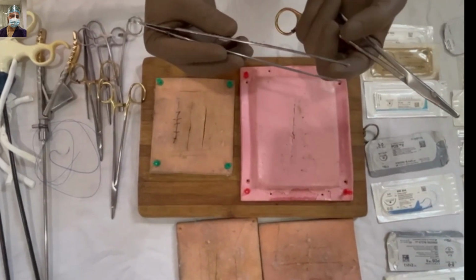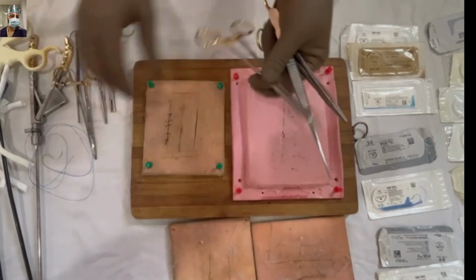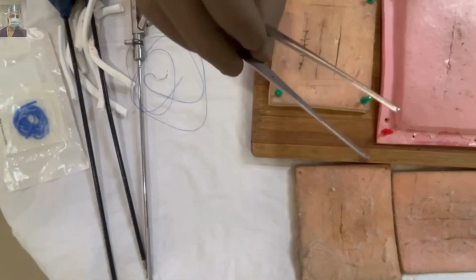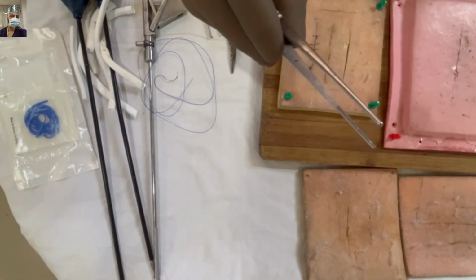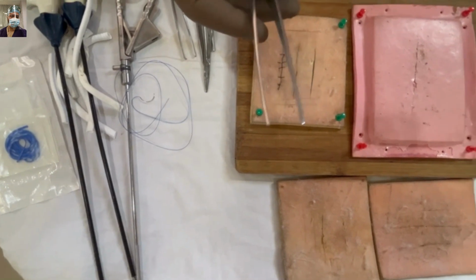And palmar technique, when you are doing a long surgery, a long haul of suturing, gives a fatigue-less experience. This is DeBakey forceps, and friends, just for the introduction, these are vascular forceps, atraumatic, and this is less trauma to tissue. So we will also introduce other instruments as we progress in this suturing series.